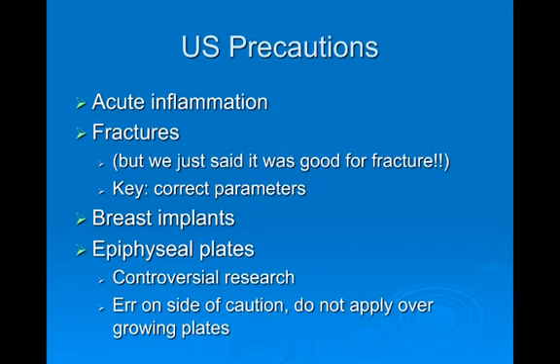running an ultrasound head over someone's tibia, looking to see if they get a reaction. Because if there's a fracture site there and you turn that up nice and high, you can get a nice pain response out of that. So fracture, not a contraindication. You're going to get a pain response. On very low settings, we're going to get some healing.